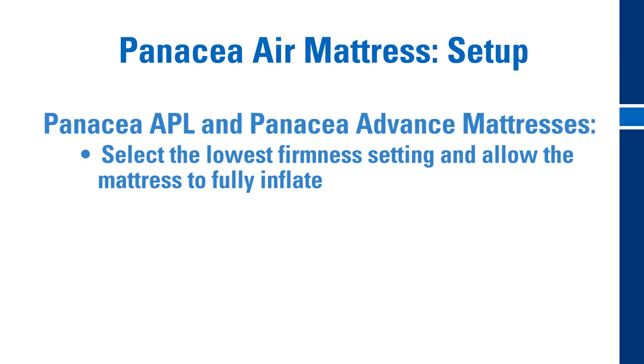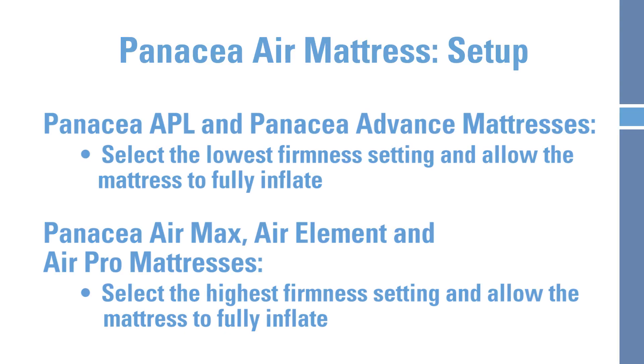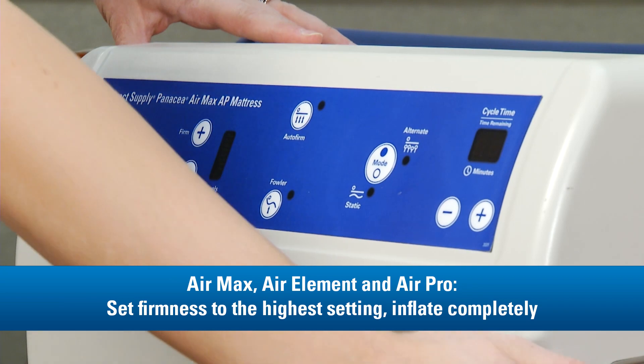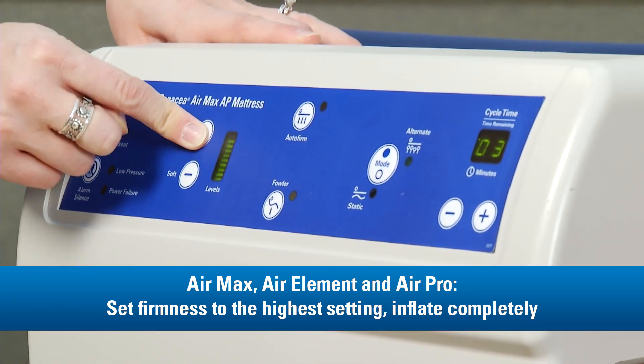For the Panacea APL and the Panacea Advance, set the firmness level to the lowest setting and allow the mattress to fully inflate. For the Panacea Air Max, Element, and Pro, set the firmness to the highest setting and allow the mattress to fully inflate. Depending on the model, this will take between 1 and 40 minutes.